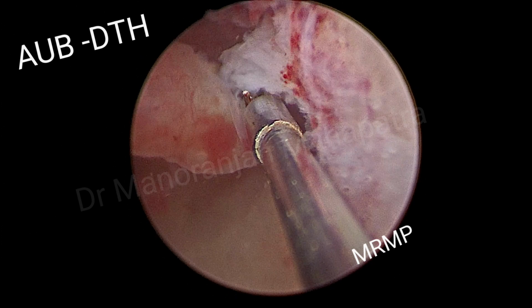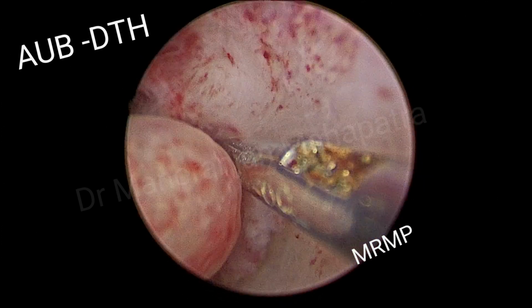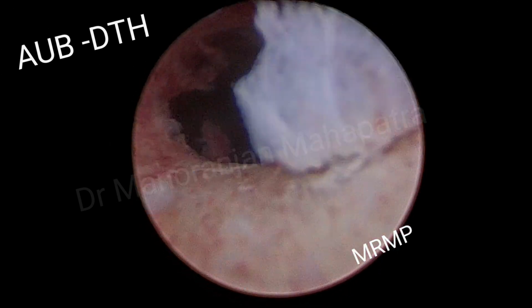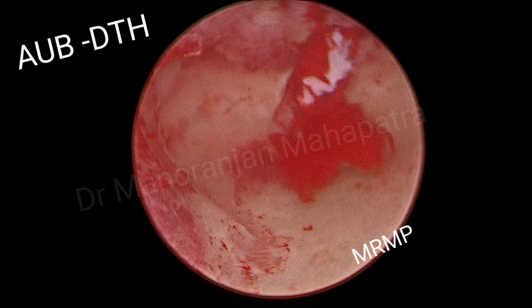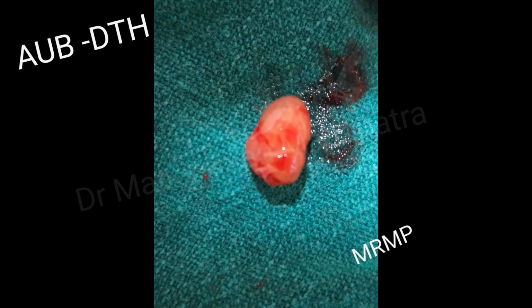This patient had received multiple hormone therapies for the last 1 year from multiple consultants, and was then subjected to hysteroscopy and resection by cold scissors, followed by a completeness check, and thorough curettage was done. No hormone therapy will be given afterwards.